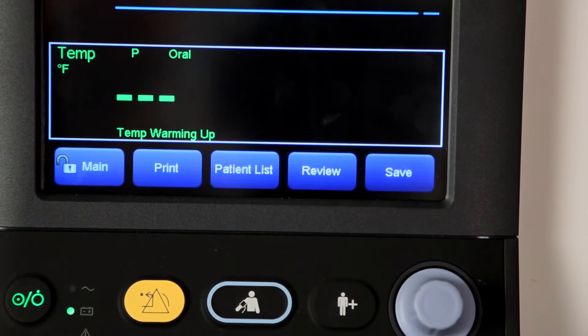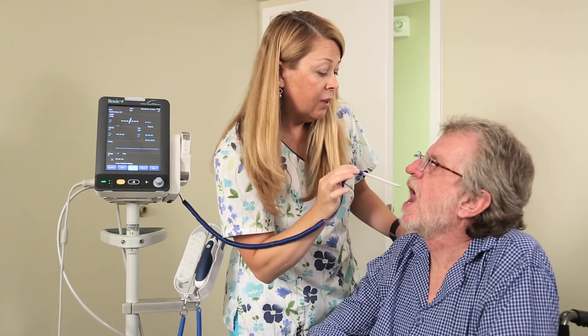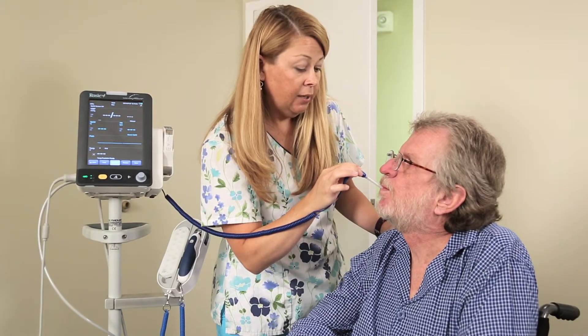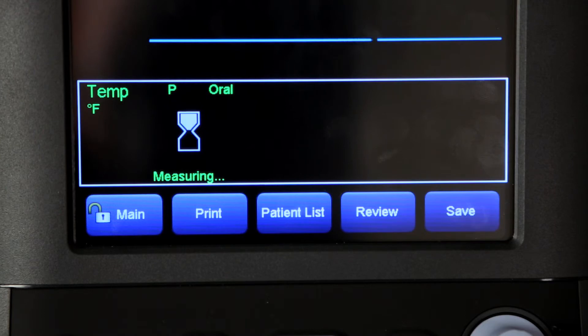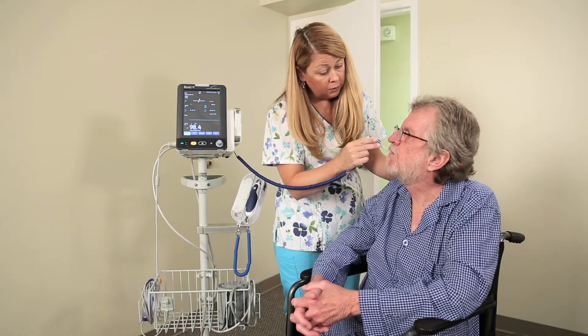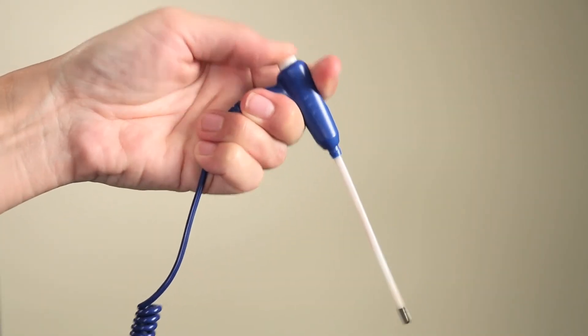The Rosie 4 monitor sounds two beeps and displays the message 'Temp Prediction Ready' on the screen when warm-up is complete. Then you can place the probe at the measurement site and wait until the measurement stabilizes. When the dynamic hourglass symbol appears, it indicates that Rosie 4 is starting to take the measurement. The monitor sounds a beep when the temperature measurement is complete. Withdraw the probe and firmly press the ejection button on the top of the probe to eject the probe cover.